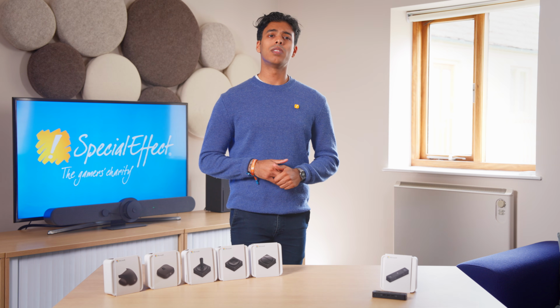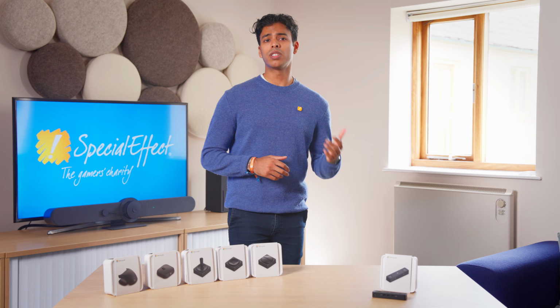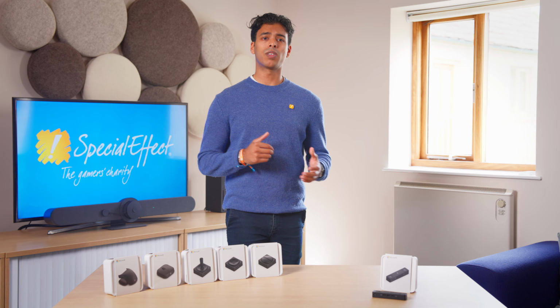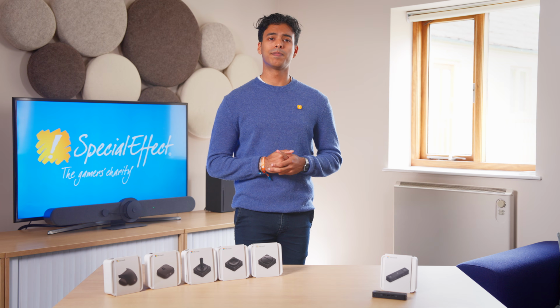It's important to note that some in-game actions require an input to be held continuously or for a set duration to activate it, so you will need to be mindful not to cause any conflicts when choosing which keys to assign for a short press and a long press.